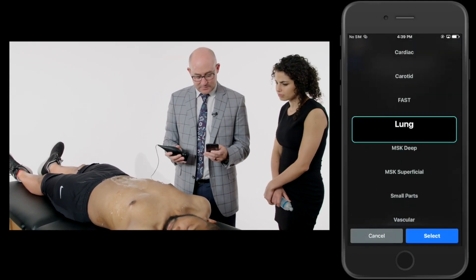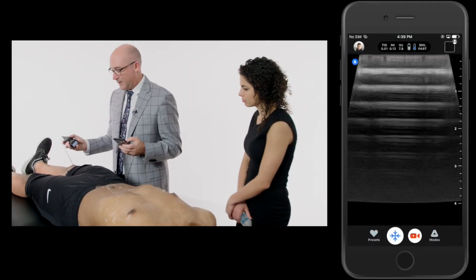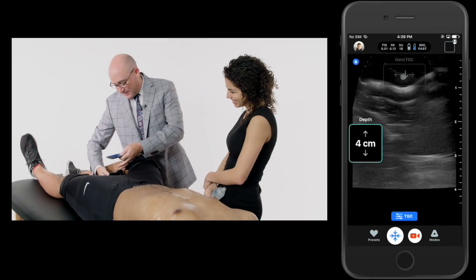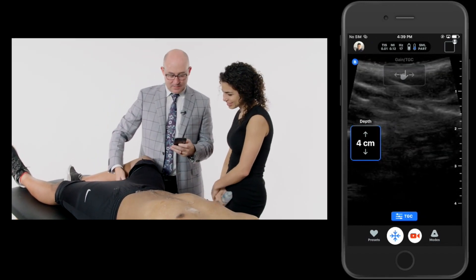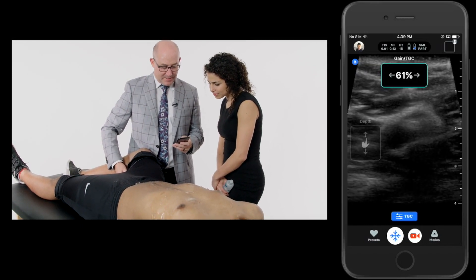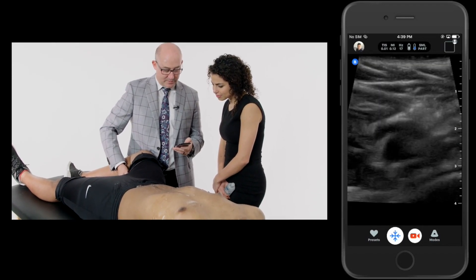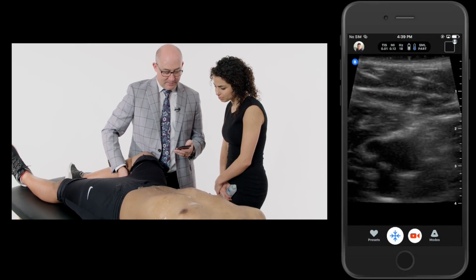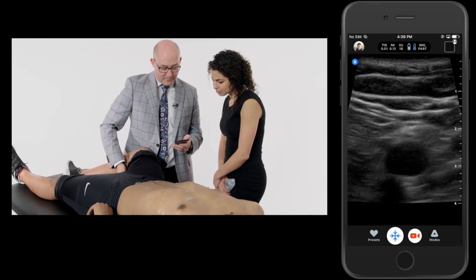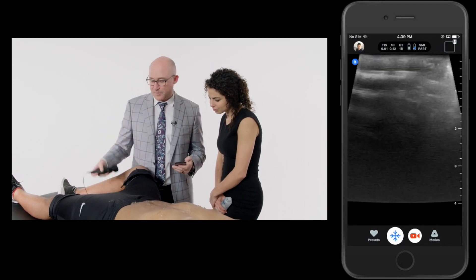Let's go back to vascular or small parts and take a look behind his popliteal fossa to rule out a DVT. Here I am in the popliteal fossa — I'm going to turn up the gain a little bit. I can see the vein at the top of the popliteal fossa and it's easily compressible there. See that vein compress? Then ease up, it fills again. Compress, ease up — going through his popliteal fossa. No clot in the popliteal fossa. Very good.